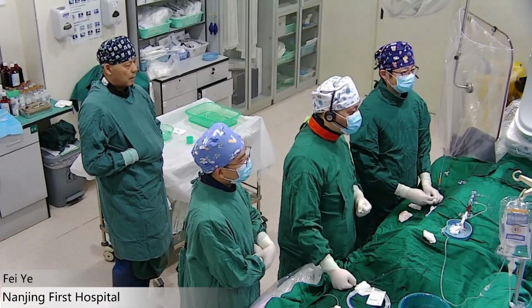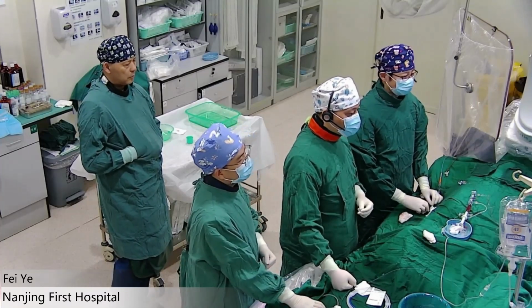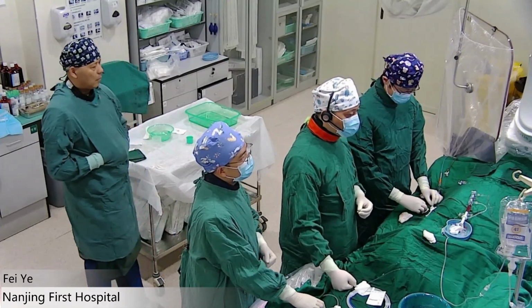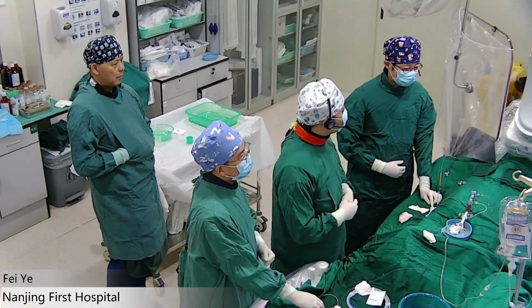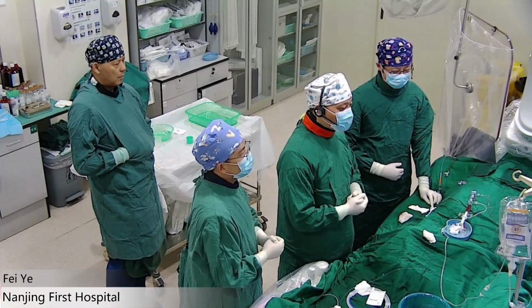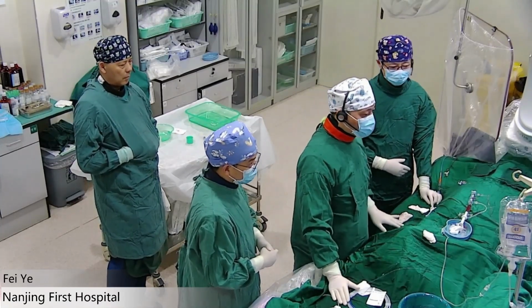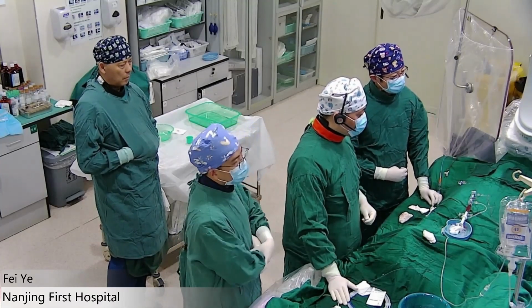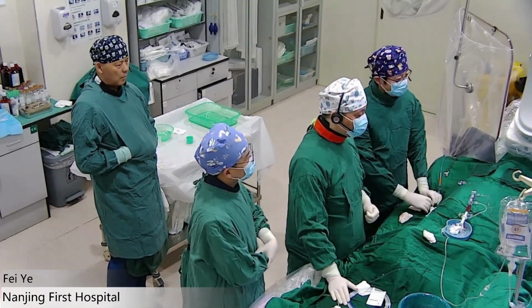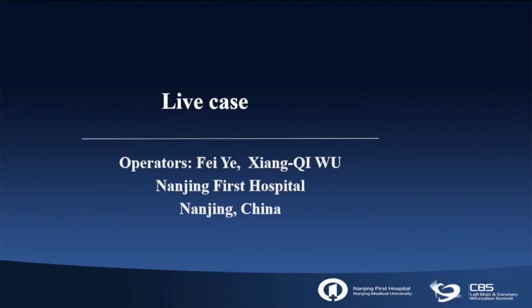Thanks and good morning, every expert here. This is a transmission from Nanjing First Hospital. We are very lucky to have this opportunity. We will show today's case, and Dr. Wu will introduce this patient's characteristics at baseline and our plan, and maybe we can get some recommendations from experts here. So please, Dr. Wu.